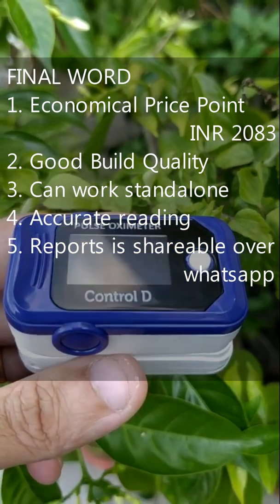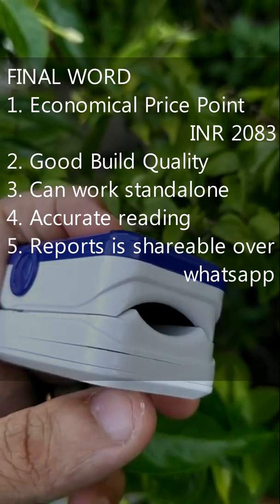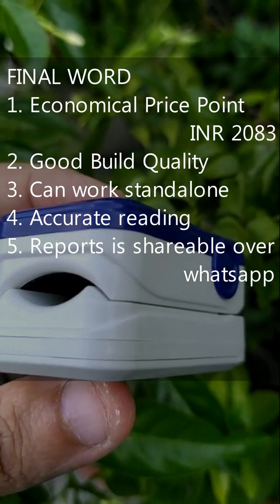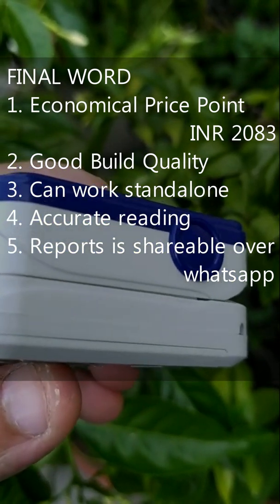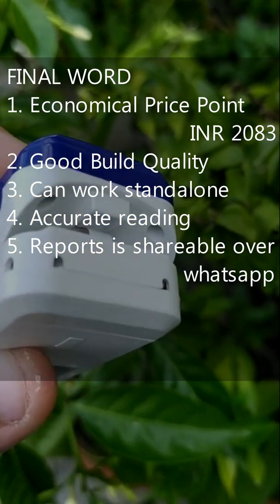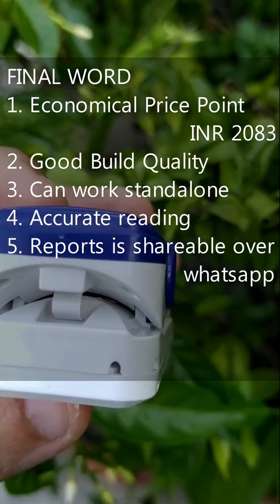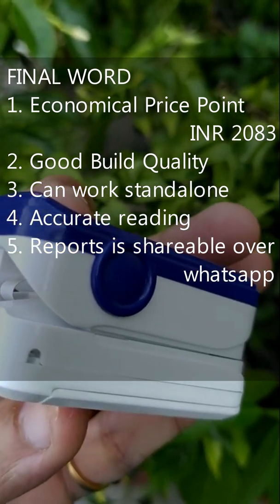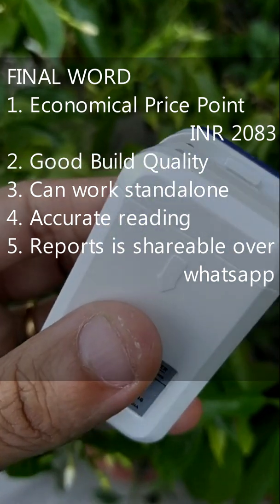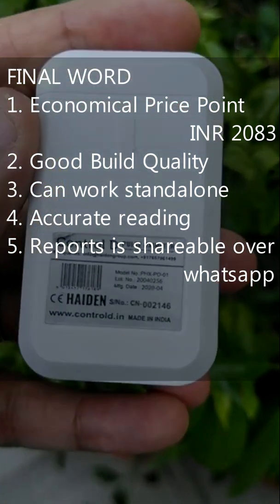The final word for me is that it is beautifully priced at approximately 2000 rupees at FirstCry — that's a deal, with most oximeters priced around 3500 to 4000. The build quality is not cheap and is fairly good. Two of the biggest positives are that it can work standalone without needing to be paired with a phone, making it compatible for all age groups, and it works simply on two AAA batteries without needing to be charged — again, making it ideal for elders who are not always comfortable with plugging and charging a device. Transferring the report through WhatsApp and email makes it very versatile to share documents and information with doctors, especially during COVID times.